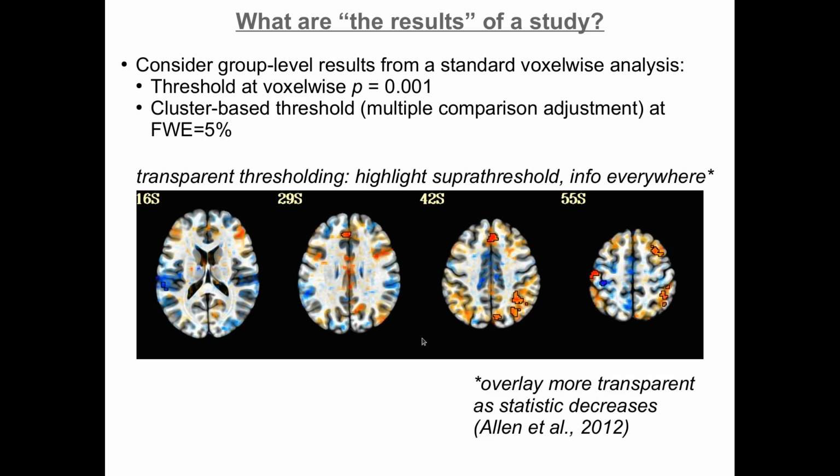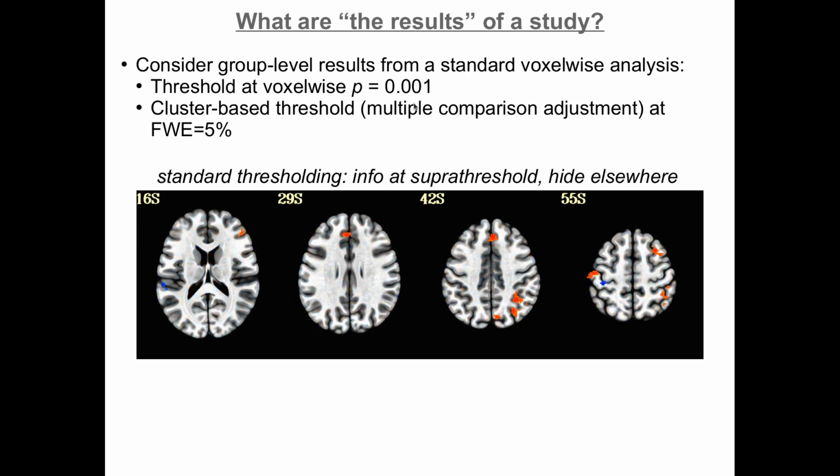And it's true, the immediate objection some people have is, well, it's below the significance threshold, therefore it must be wrong or bad or incorrect or not active. I think part of the main purpose of this talk is to convince you that that's probably not a good way to think about neuroimaging, for many reasons. This arbitrary threshold of p of 0.001 could easily be p of 0.002 or p of 0.00005. Why should this value be the exact arbiter of everything that is on and nothing else we need to know about?